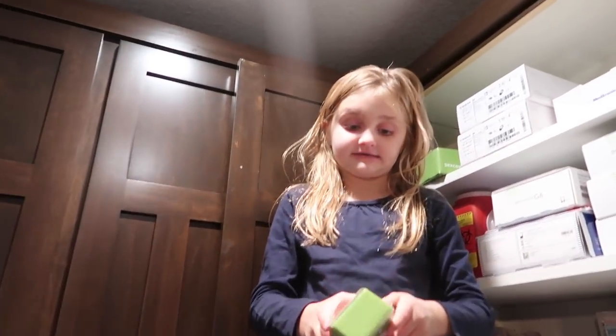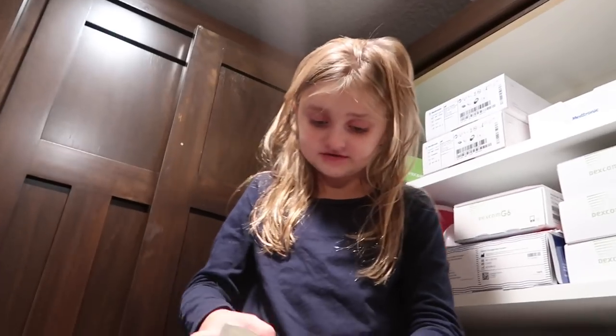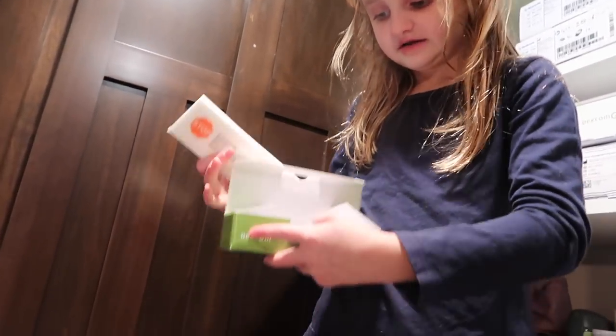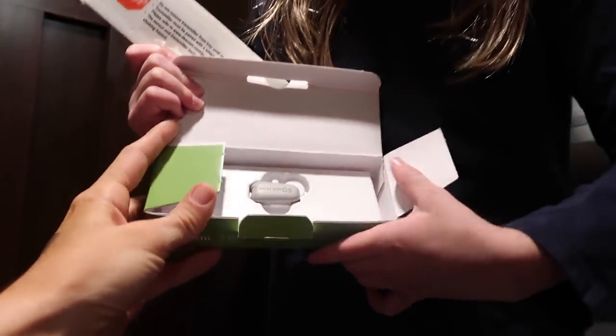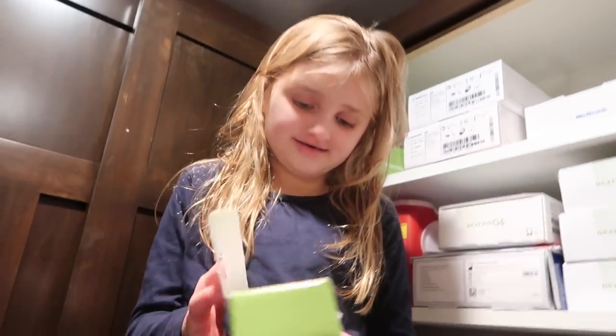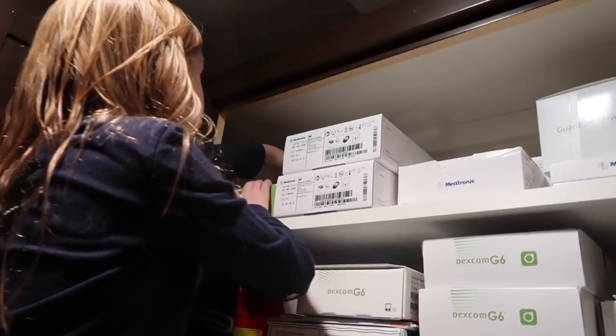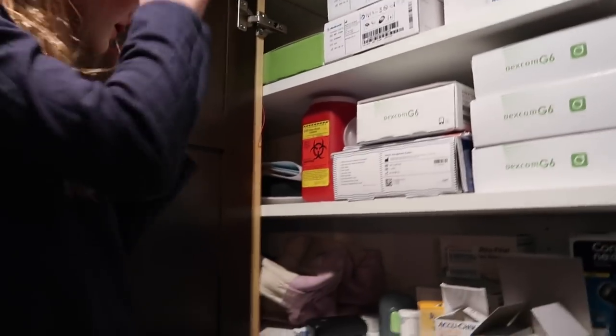This is the box that we had for my old Dexcom G5, but now I have the Dexcom G6. This is the transmitter — that's so tiny. That was the G5 transmitter. That's just a Dexcom box from her other one.